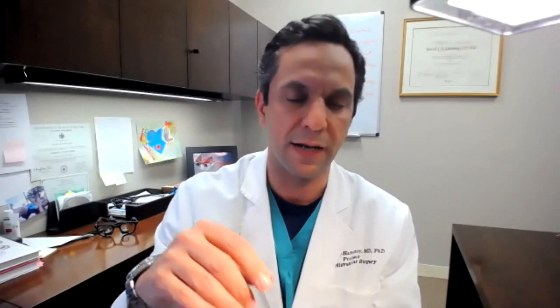One of the ways we try to mitigate that risk of reoperation is by reducing the size of the aortic annulus so that it matches that of the pulmonary. We do that using an extra-aortic annuloplasty. I place the annuloplasty sutures after I've mobilized the aortic root, before I've even harvested the autograft. The size of the ring depends on the size of the pulmonary annulus. Let's suppose the pulmonary annulus is 26 millimeters. I'll choose a ring size of 26 plus about 5 or 6 millimeters.